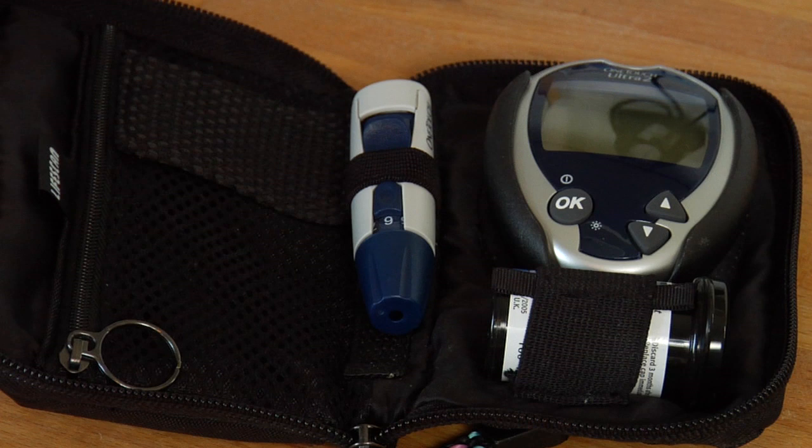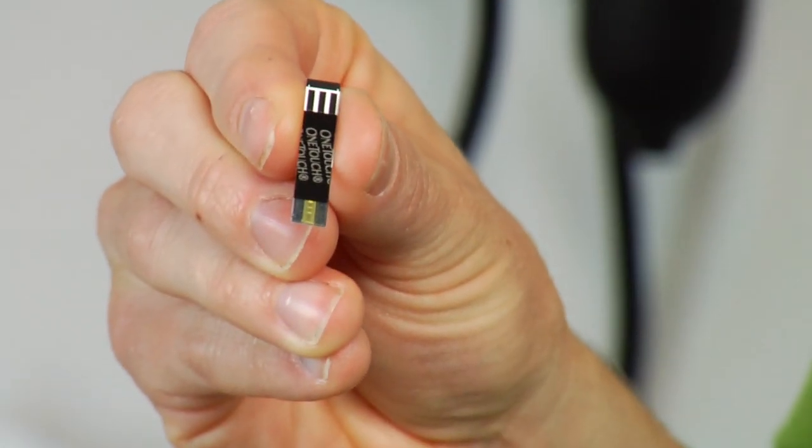This can also be called a glucometer. So basically, this is something that has evolved over many years, and currently we're using products that have a glucose oxidase enzyme present in the test strip. This being present in the test strip is what the blood that you're sampling first connects with. And this is going to create a current.